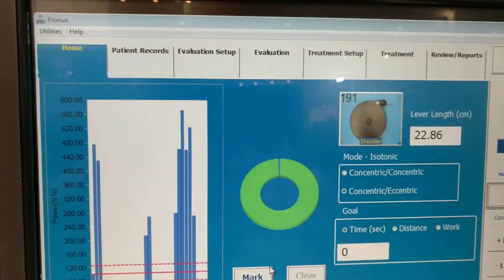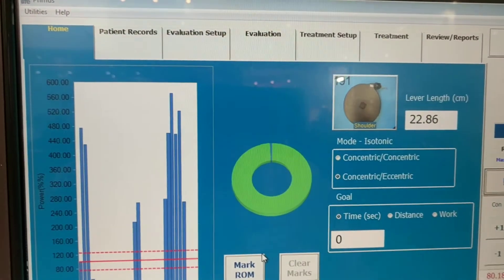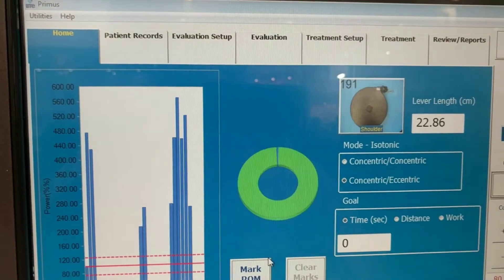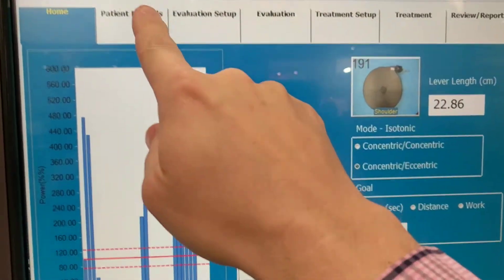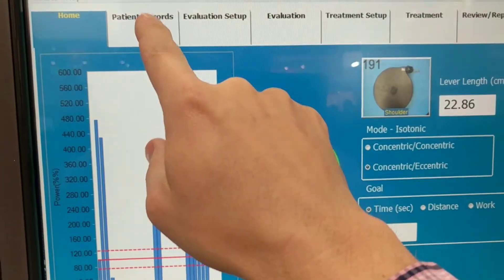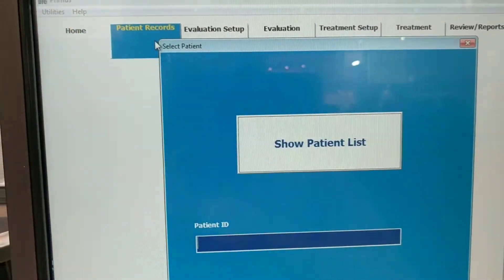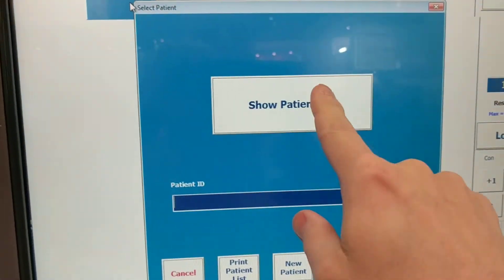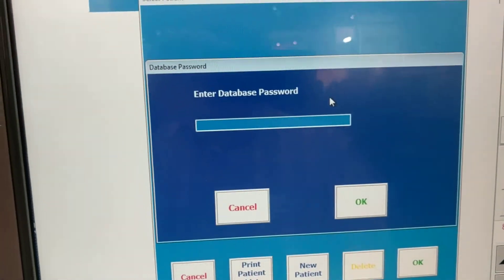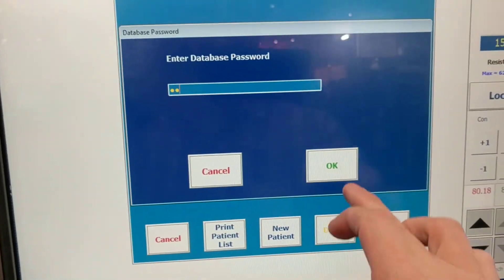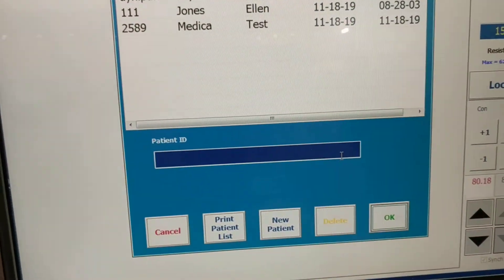On the Primus RS software, we're going to show you how to quickly set up a patient record. Using the tab up top, move to your patient records. You want to show the patient list, then use your dedicated password.